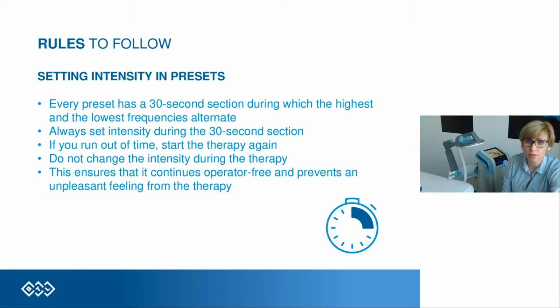So we have 30 seconds from the very beginning to adjust the intensity to the level which is comfortable for the patient and which is effective from our point of view. Because if we want to relax muscles, we will not apply as much intensity as we would use, for example, if we wanted to strengthen the muscle. So we have the first 30 seconds to adjust the intensity. And after that, we are not changing intensity at all. If 30 seconds is not enough, we should stop the therapy and run it again.